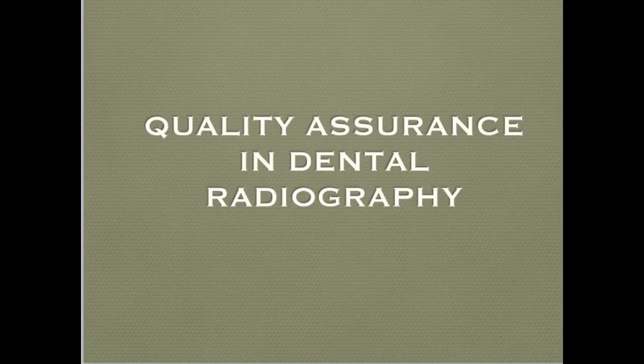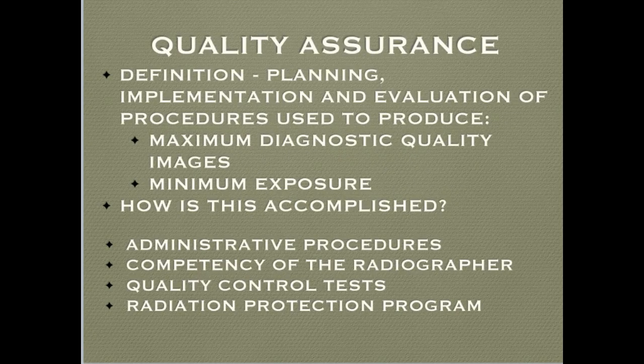This presentation is intended for the dental assisting student. The topic is quality assurance in dental radiography. What is quality assurance? It's the planning, implementation, and evaluation of procedures used to produce our number one goal, maximum diagnostic quality images with minimum exposure to the patient and the radiographer. So how is this accomplished?